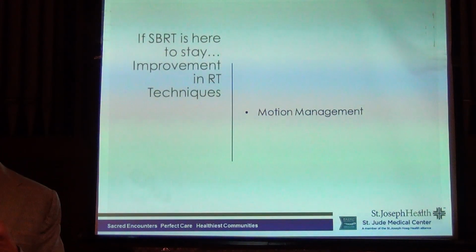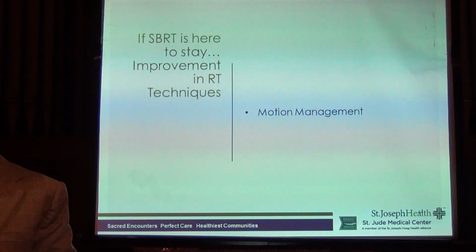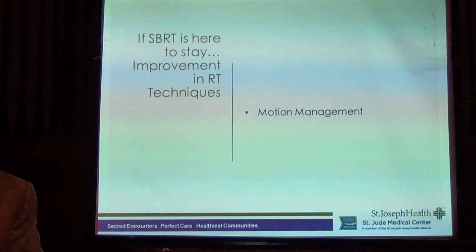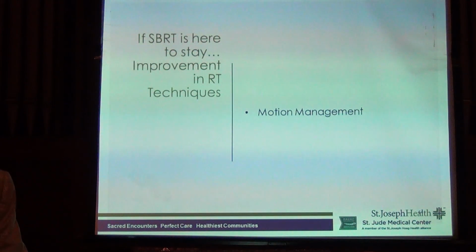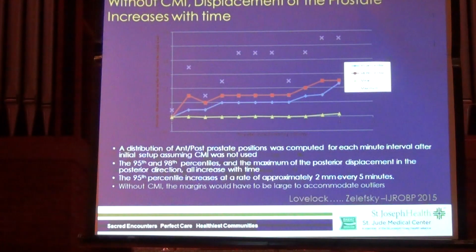So the problem we have today is our technology grows so quickly that by the time something is 10 years out, becoming the new standard of care, we're at 2, 3, 5 years for the next technology. So at some point, we have to look at where we follow up the patients and say, we need to start doing newer techniques. So this is something that we're starting to employ for all our patients, but we are doing it for SBRT, where we're monitoring the patients real time. And what we're finding is that if we go faster and if we monitor closely, we have fewer side effects.